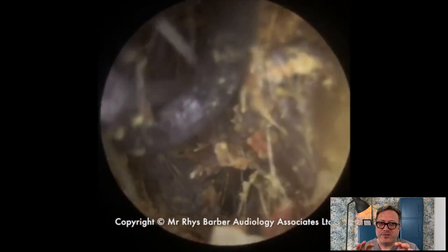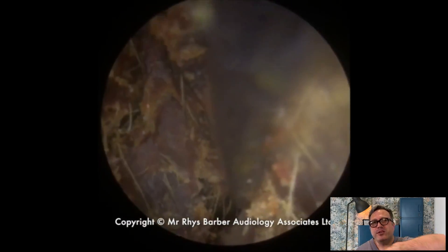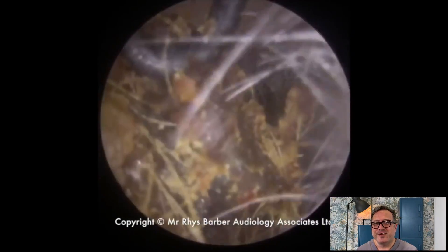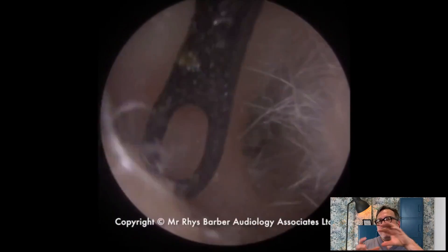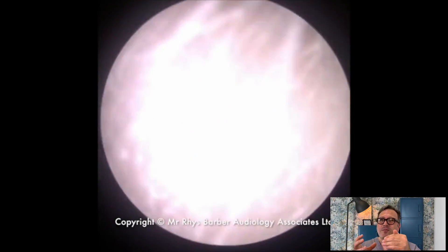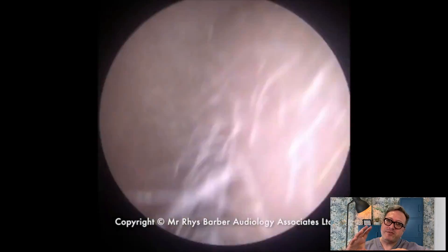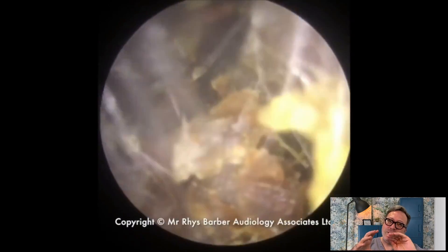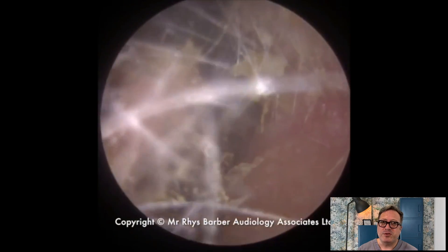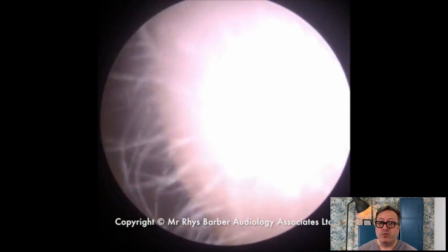I'm just going to try and pull this right hand section forwards, but it's just detached from the section behind. We've got to be careful — if we chip away too much of this outer section there's not much of a gap at the top, so it's going to be difficult to get a good grip behind. But we've managed to get a bit of purchase behind that front section, and pulling that forward actually brought some of the wax forwards as well.